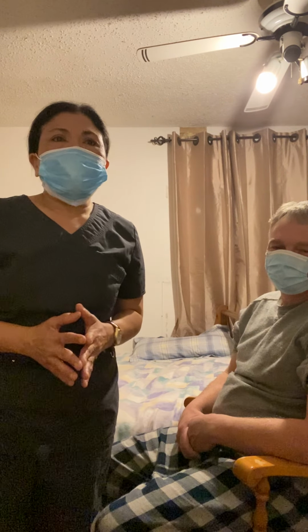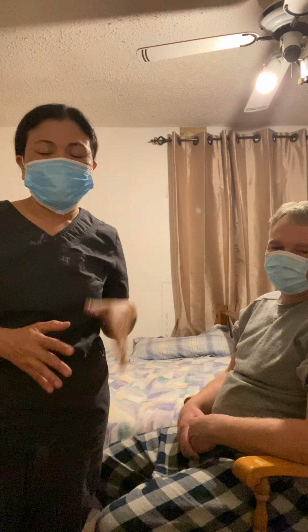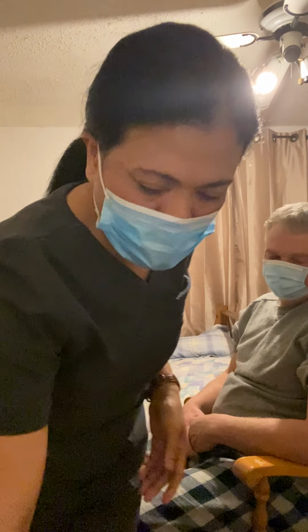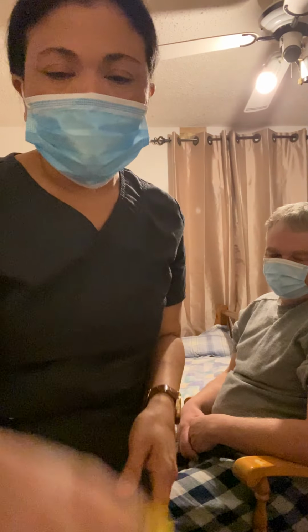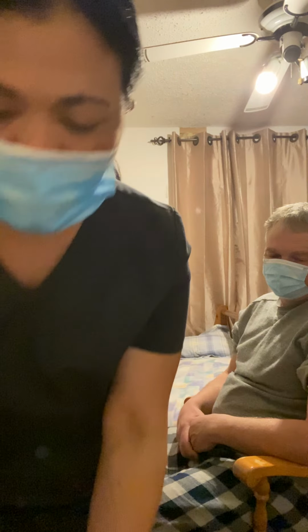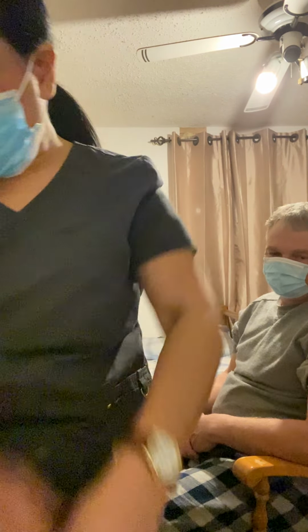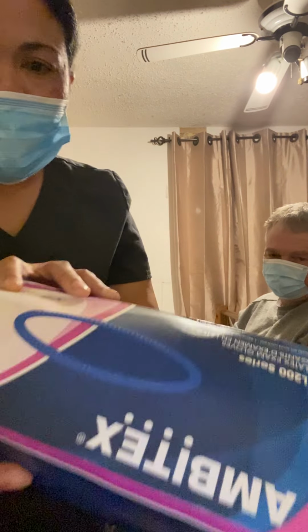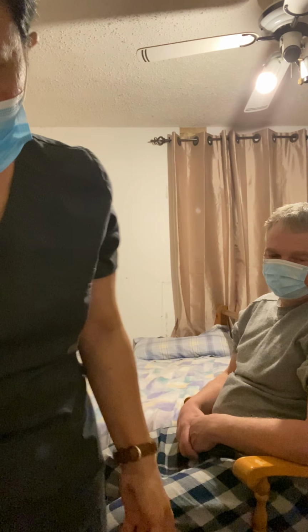Good morning. So today I want to demonstrate how to perform vital signs. The first thing we want to do is gather our supplies. We have our stethoscope, our pulse oximeter, our blood pressure cuff, our watch, our hand sanitizer, our gloves, and our disinfectant wipes.